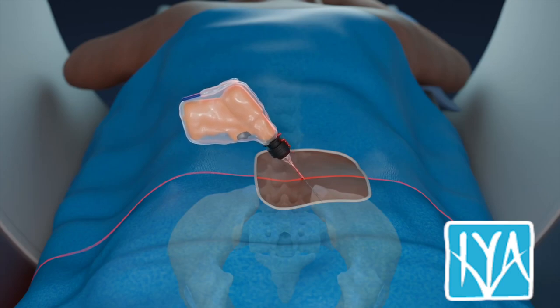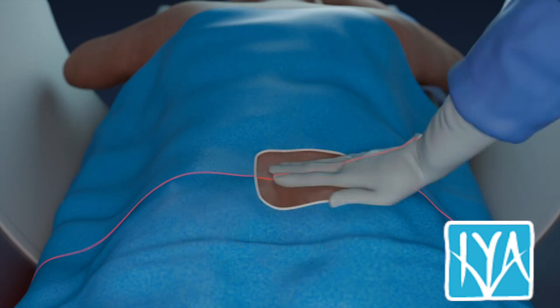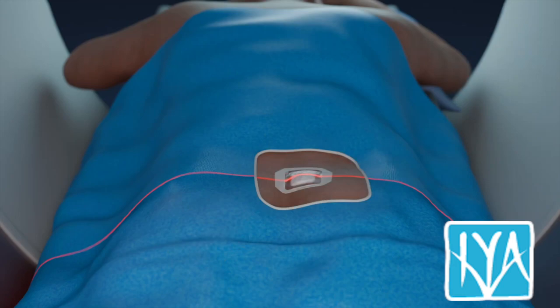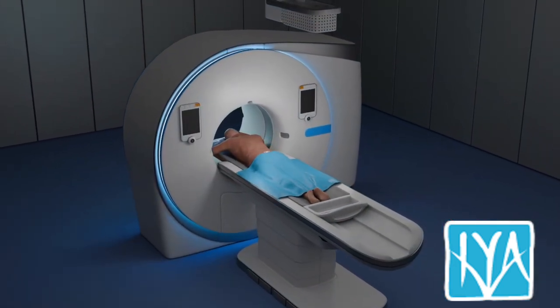Once the sample is collected, the needle is carefully removed, and the biopsy site is compressed to control bleeding. At the end, a sterile dressing is applied at the access site. A final CT scan may be taken to check for complications such as hematoma formation.